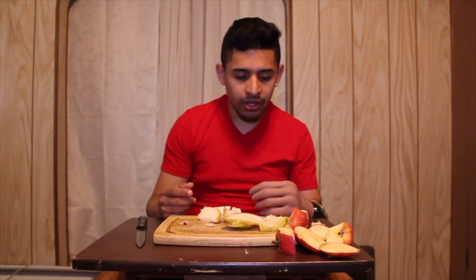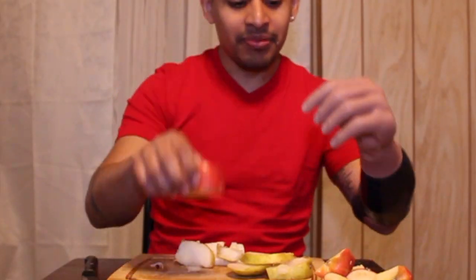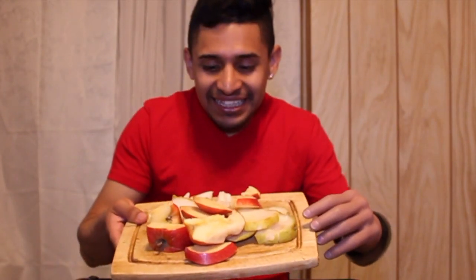I really don't use my prosthetic when I'm cutting food usually, but sometimes I use it when I cut things. This is my first time doing this on video, but I love it — it's funny. You can do a lot more things with it, so that's good. I didn't realize it was going to be this hard to cut food. I got a bad pear and bad apple, but at least I managed with this hand.